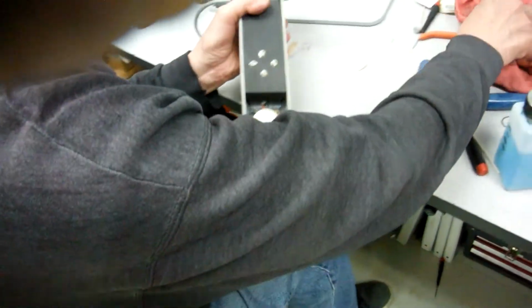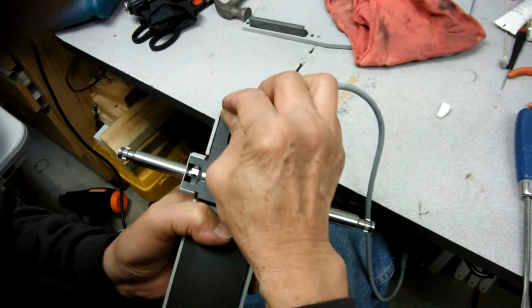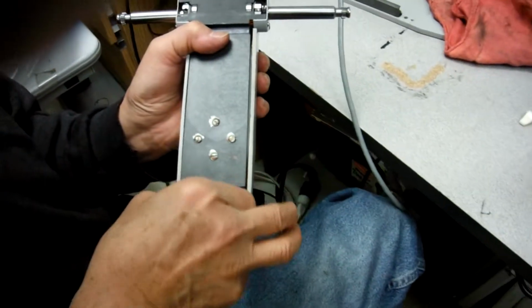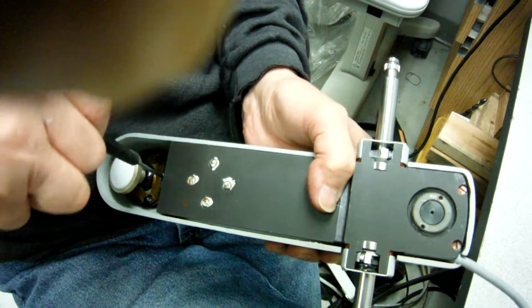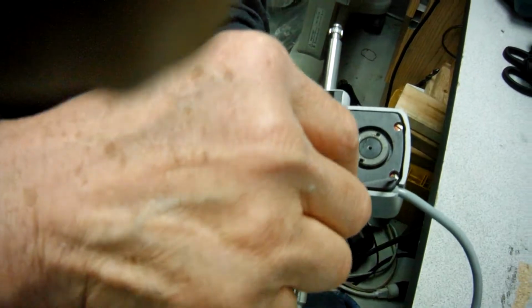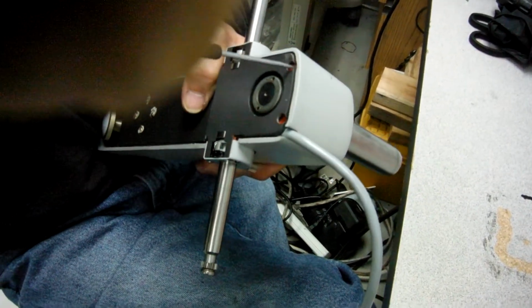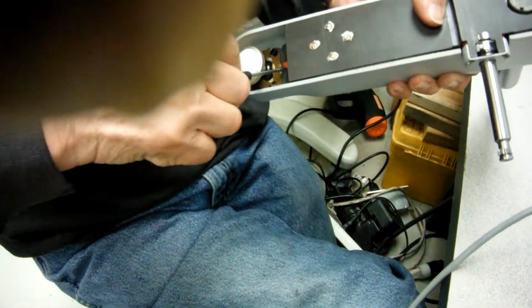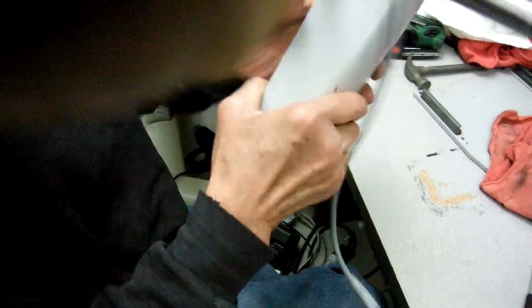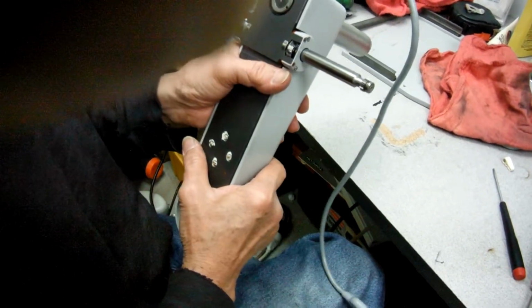After you put it all the way down there, then you can put the 3 screws you took out. 1, 2, and 3. Tighten it as much as you can. That's it. If you want, you can also put the nail polish on the top of that, just like the old one right here, to make sure they're not coming out.